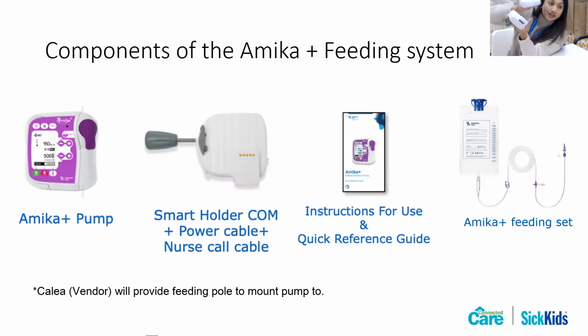And then whenever you need the Amika Plus pump to be docked onto the smart holder, you essentially just place it like this on top, slide it down until you hear a click. All right. Essentially the pump can also function without the smart holder, but for it to be charged, it needs to be connected to the smart holder.